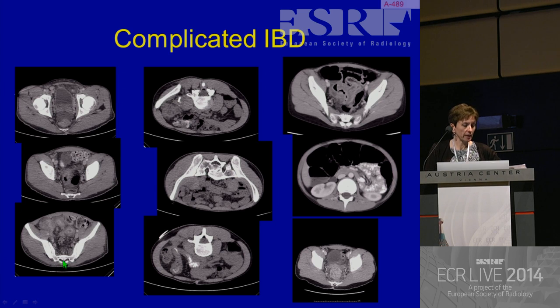So this patient here was having an acute flare-up. They had been managed medically by the surgical team, but they just weren't settling. Ultrasound had shown there were lots of dilated loops. You can still actually see the layers of the wall here, so that gave them hope. She was on steroids. See all the creeping fat here? She had a lot of nodes. They saw this free fluid in the pelvis, but what they couldn't work out is, was there anywhere where they could actively go and drain it?